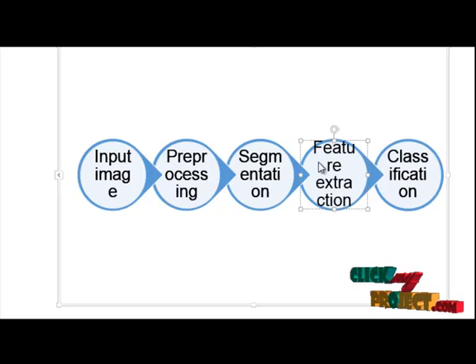The next feature extraction method is HOG, the histogram of oriented gradients. HOG captures edge or gradient structures that are characteristic of local shape. It is an image descriptor based on the image's gradient orientations. We extract the numerical values from HOG. The HOG descriptor is based on dominant edge orientations. The image is divided into cells.